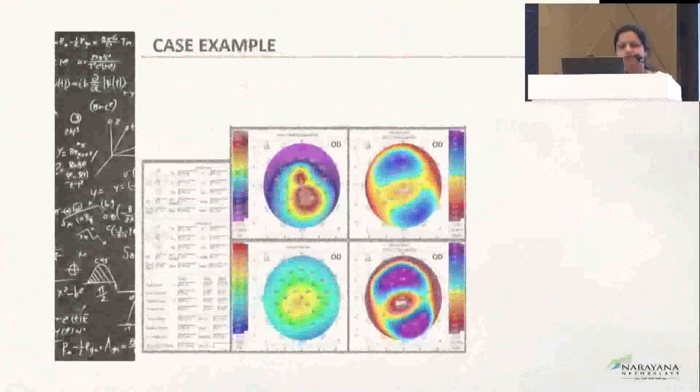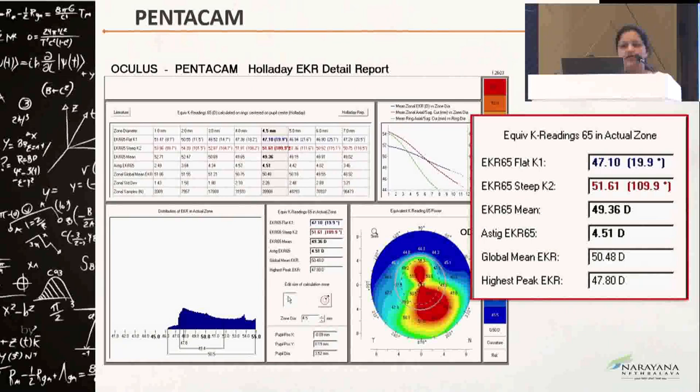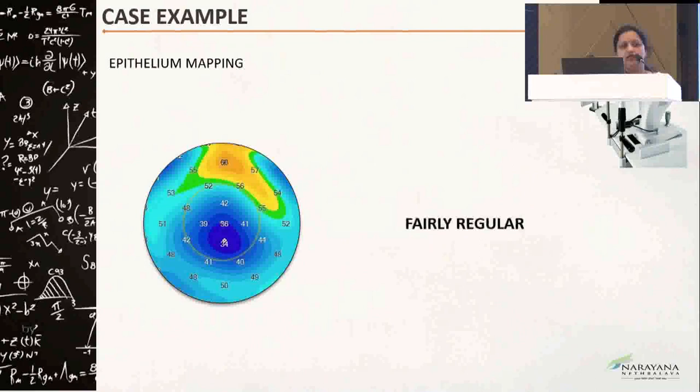This is a case example. A 55-year-old with grade 1 NS to PSC. We can see the inferior steepening in the first graph. The posterior elevation is around 98 microns and the anterior is around 23 microns. The EKR is giving us a reading of 47 and 51. Coming to epithelial mapping, we can see that the cornea here is quite regular. The IOL Master K is around 50 and 58.